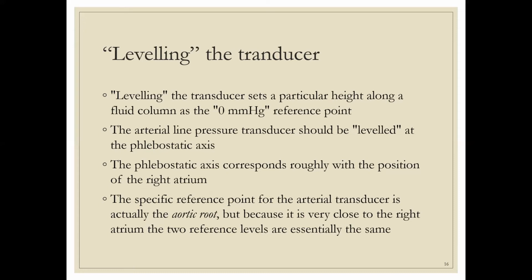We see how the posture of the patient is, whether head elevation or supine. Then we see where the 4th intercostal space is, where 5 cm below the sternum is. Then we draw a line parallel to the ground from this point. And then at a pole nearby, we fix the transducer. This is known as leveling.